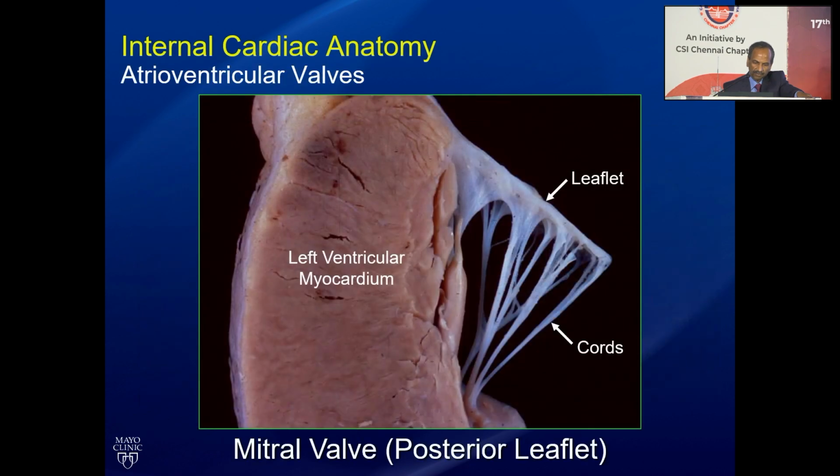What is the reason for that? It is because there is thickness of myocardium and the annular tissue that separates the CS, which is outside the heart, and your catheter, which is inside the heart. If it is touching, that means you're atrial. You're just pushing the atrium to try to reach towards the CS electrode. Simple pathway can be made difficult by not having the optimal positioning of the catheter.